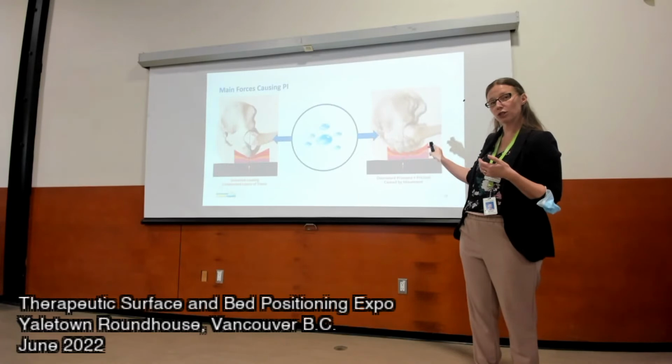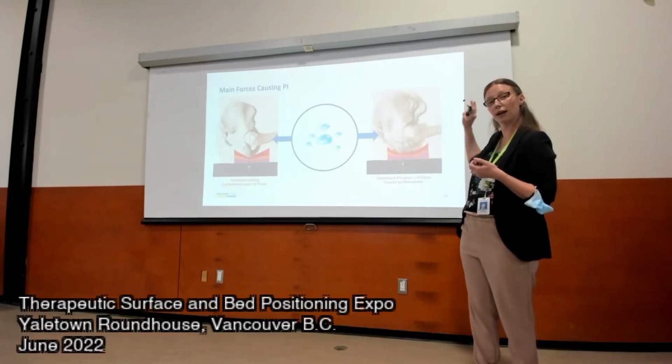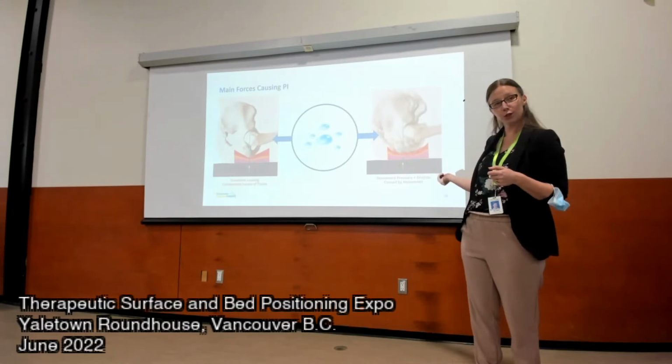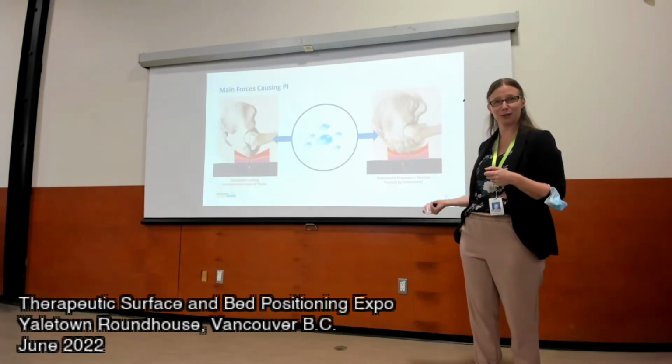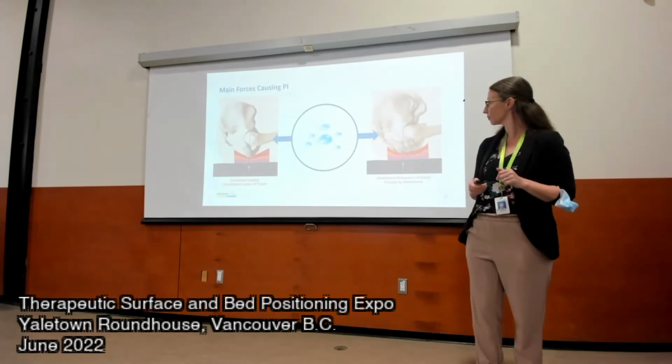The other thing about shearing is that it will double the impact of pressure. So we really need to make sure that we do everything that we can to reduce that movement. And friction is now considered part of shearing. So friction being the movement of two surfaces.